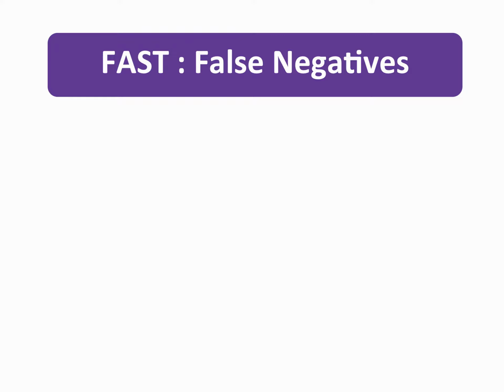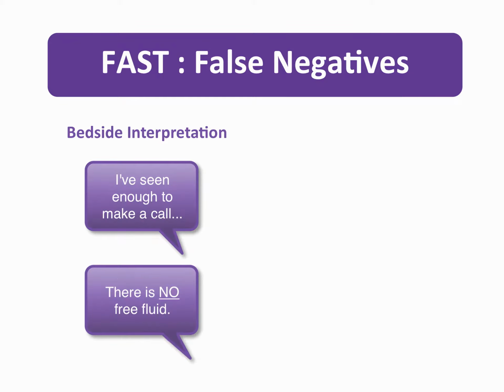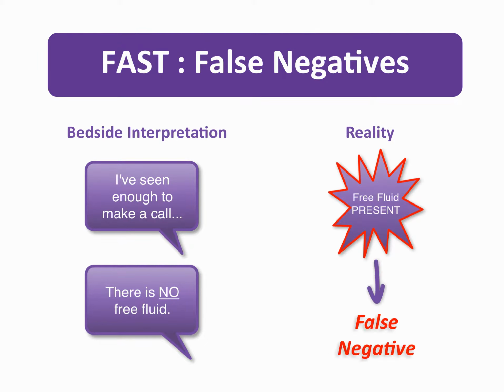Let's explore potential false negatives with the FAST exam. This is a dangerous scenario when the scan is declared determinate, meaning you've seen enough to make a call, and negative, meaning the call is no free fluid, when there is in fact free fluid present. This may lead to serious consequences for your patients. The goal for the safe practice of bedside ultrasound in trauma is to eliminate false negative results.